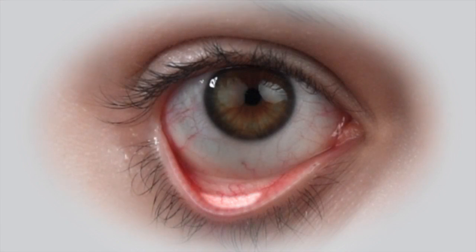Avoid touching the lid margin. Immersing the sensor in the lower tear meniscus should also be avoided. Do not touch the sclera.